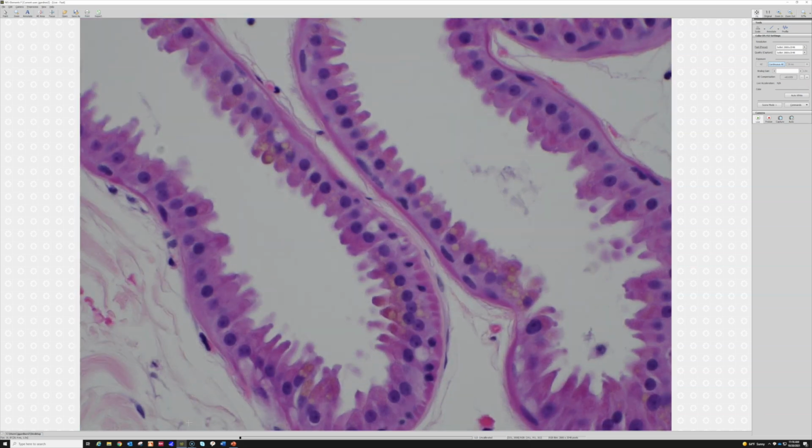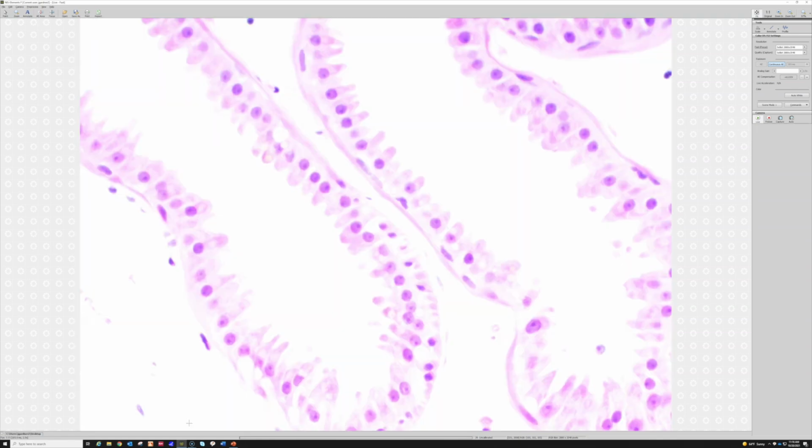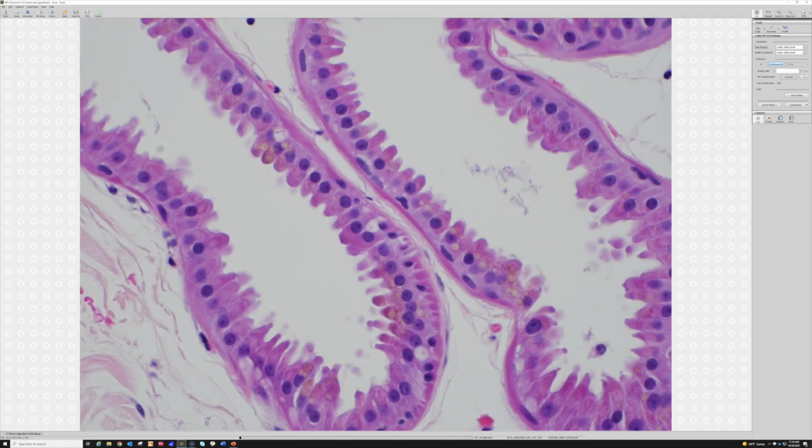And the thought in the past was that these little blebs or snouts would get pinched off, like it looks like it's happening there, right? It looks like they're falling off into the secretion, into the space, and the secretion was formed from little pinched off, dead bits of the apocrine cells. But more recent studies, my understanding at least, using electron microscopy have shown that that's actually not what happens here, despite years and years of being taught this. I had always been taught this and only learned this a few years ago.